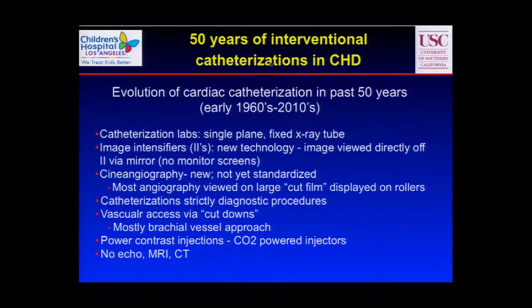At that time, that was new technology where you could minimize the radiation, magnify and intensify the image so you could see it better with less radiation. At that time, there were no monitors. You actually had to look into almost an oscilloscope to see the image. Of course, when cine angiography came along, with those plates you could run and then the 35 millimeter film, that became the next big thing. Wow, we can actually see movies now.